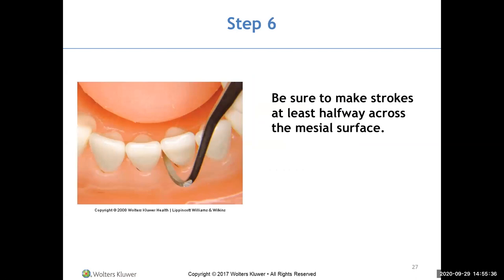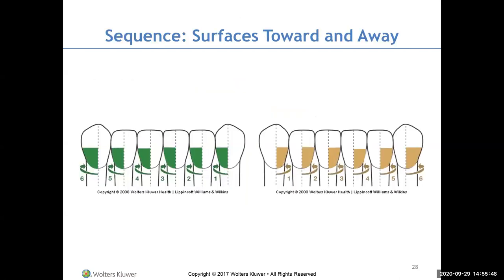Make sure your strokes are at least halfway across the mesial surface, because when you come in from the lingual, you want to overlap the mesial. Do surfaces toward you from one seating position, then swing to the 11 or 12 o'clock position for surfaces away from you.